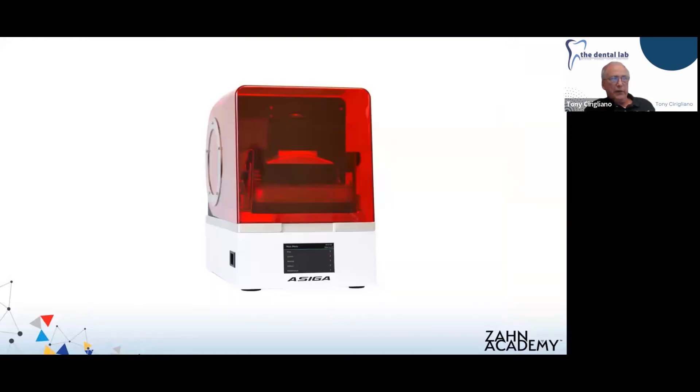When we're ready, we send it to our printer. We're using the Asiga Max, which right now is the printer that is validated for the Trusana material. As we covered last week, there are other printers in the process of being validated — they're quiet about which ones, but they are on their way. So in case you don't have one and don't want to buy another printer for your laboratory, other validated printers are coming.